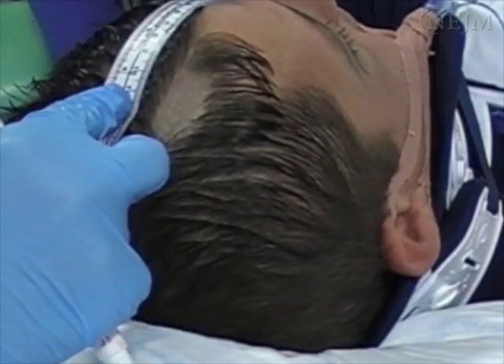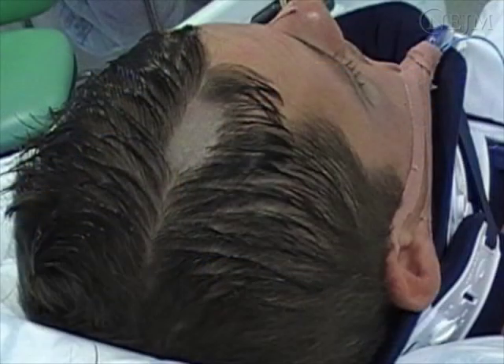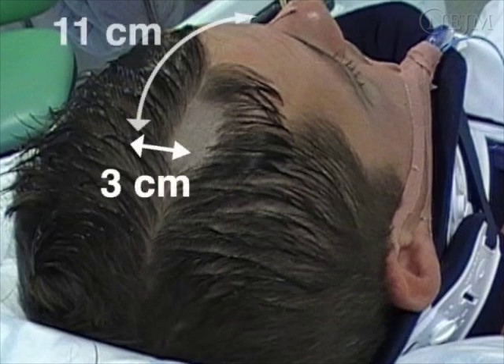Identify the anatomical landmarks and mark the incision site. Generally, ICP monitors are inserted on the side of the non-dominant hemisphere, which is usually the right side. The incision is made along the mid-pupillary line, 3cm lateral to the midline to avoid the sagittal sinus, approximately 11cm posterior to the nasion, and at least 1cm anterior to the coronal suture to avoid the motor strip.